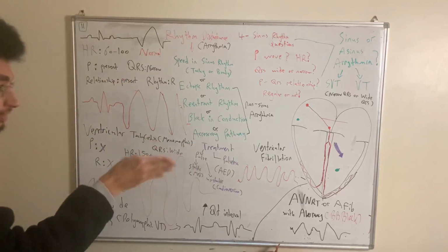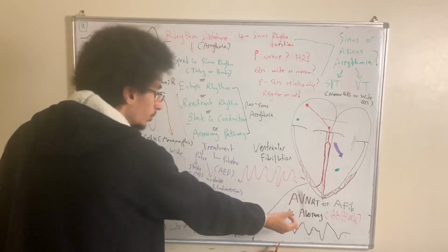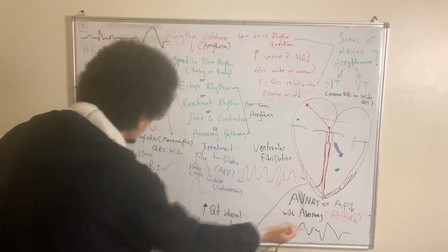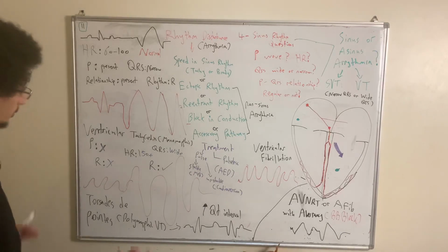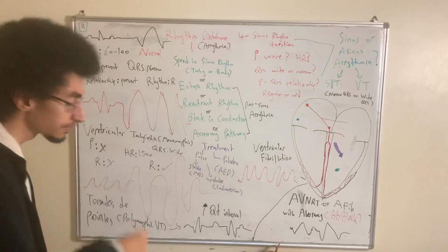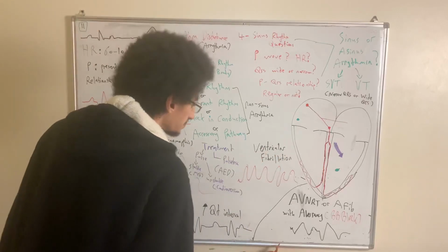And if you're telling me this exception, how am I going to differentiate this arrhythmia with aberrancy from ventricular tachycardia if both of them are wide complex? How will I differentiate? Well, let's start with a story. Let's talk about what aberrancy means.